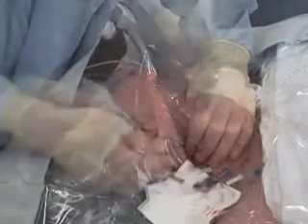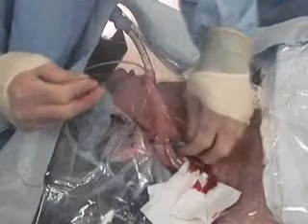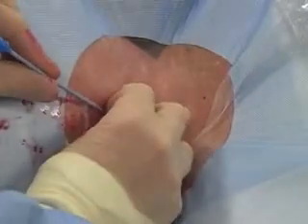While grasping the external end of the guide wire, advance the catheter over the wire using a rotating motion. If resistance is met, the track may not have been adequately dilated. Remove the catheter and try again to insert the dilator.